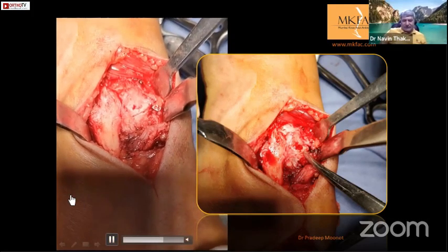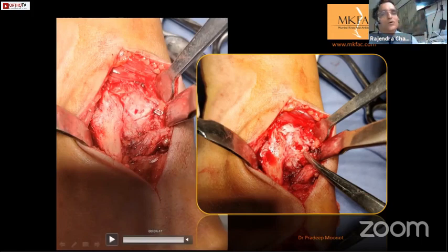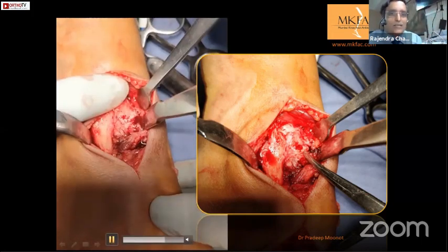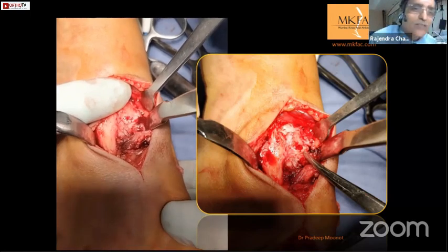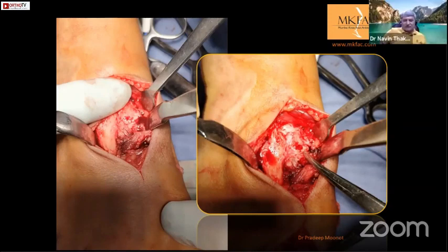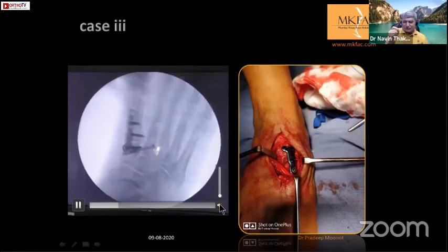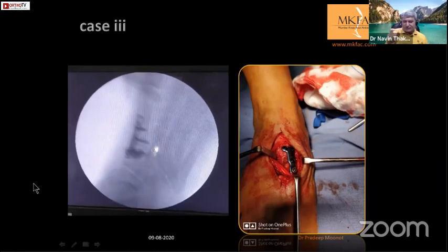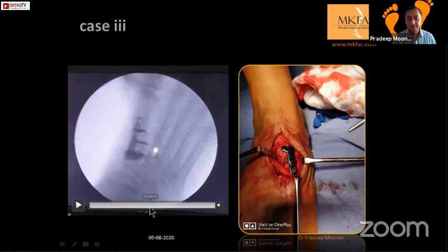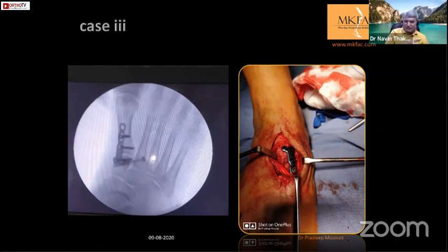It was in a different plane - also a plantar plane instability. For none of the foot and ankle surgeons is the Lisfranc ligament recreated - it is always fusion or refixation. You can't access it - you'd have to go to the plantar aspect and actually repair it, and it's so deep you will not be able to approach it.